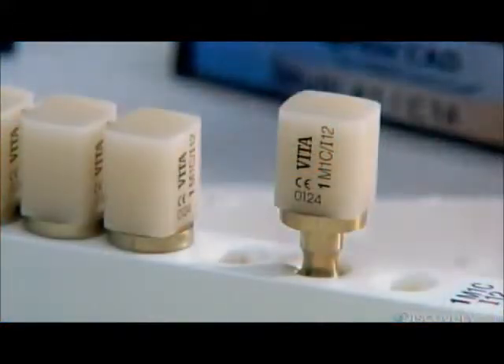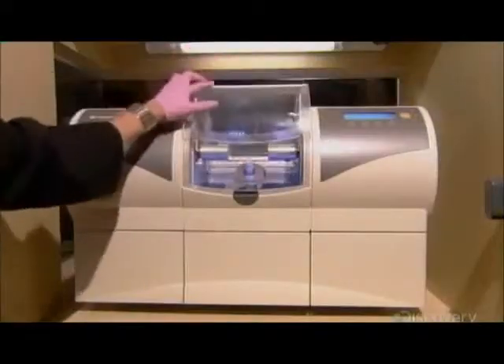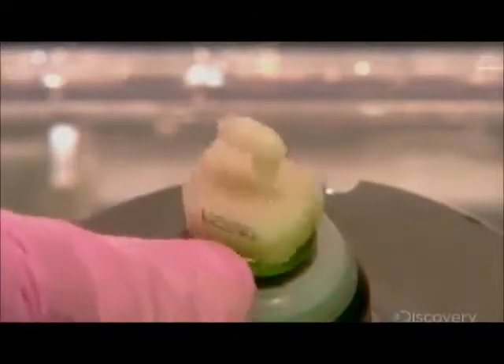The dental assistant selects a glass ceramic block of the appropriate size and color. She anchors the block in a milling chamber and shuts the lid. Two computerized drills now sculpt the block into the dental inlay, guided by the digitally produced design. This process takes less than 10 minutes.